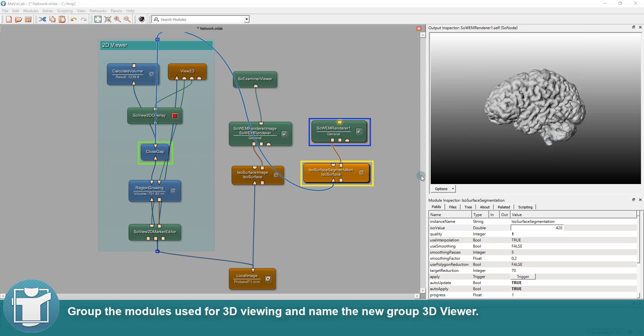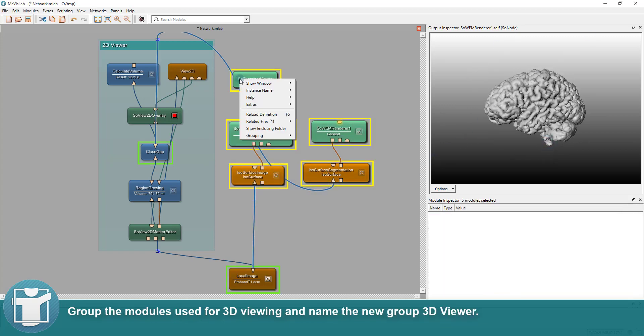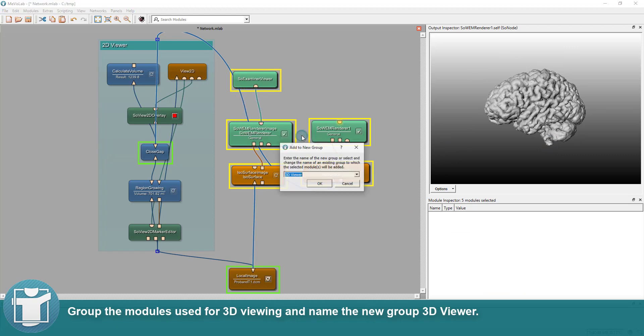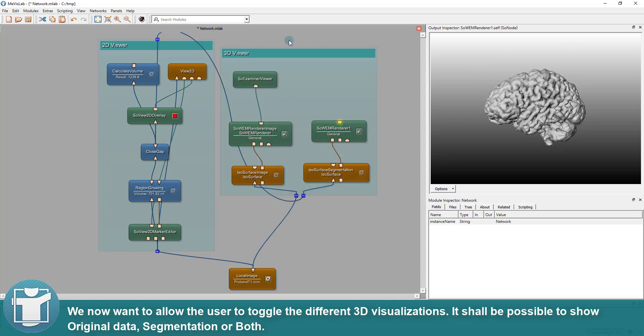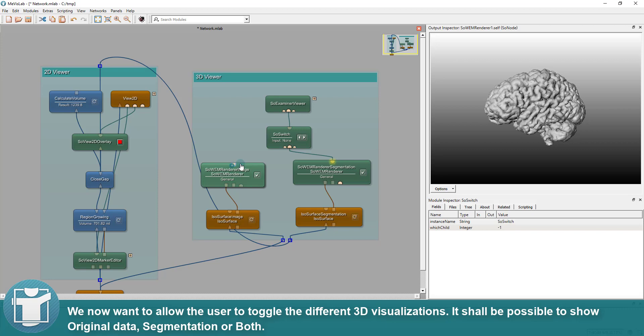Once again, we should group the modules used for 3D viewing and name the new group 3D viewer. We now want to allow the user to toggle the different 3D visualizations. It shall be possible to show original data, segmentation or both.